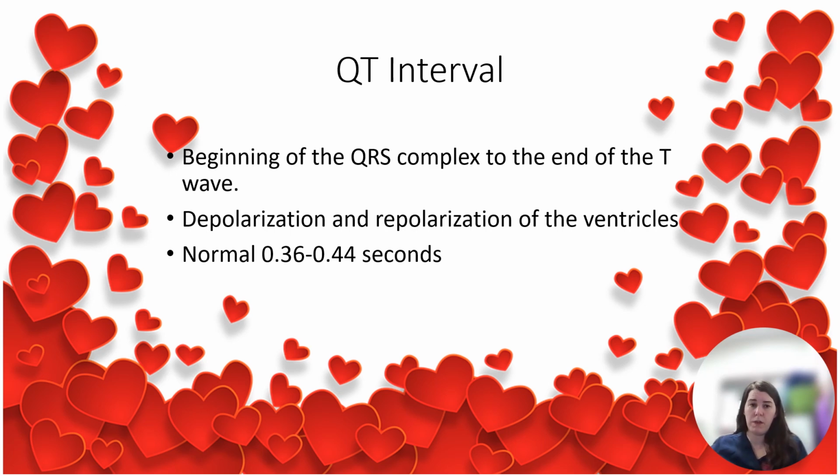QT interval is the beginning of the QRS complex to the end of the T wave, and it's during the depolarization and repolarization of the ventricles. So normal is 0.36 to 0.44 seconds.